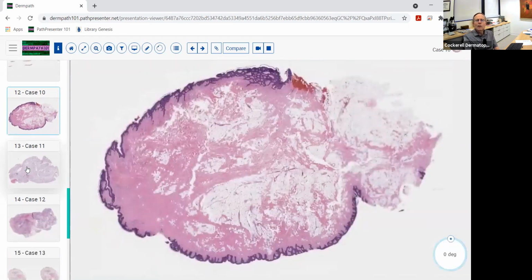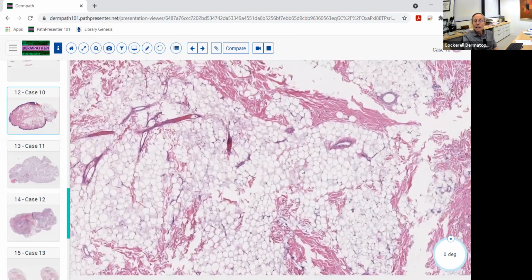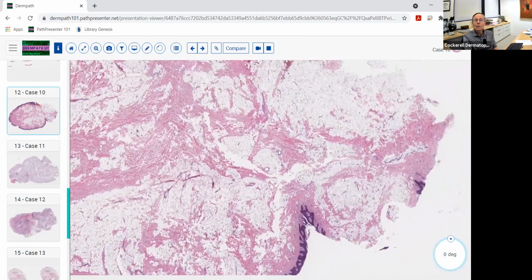And there are several other variants of subcutaneous neoplasms. There's a fibrolipoma. Again, we talked about spindle cell lipoma. We really didn't show that today, but just realize that that can look a lot like a myxoid lipoma. Now this, if you look at low magnification, looks like a skin tag. And if you looked at it in the clinic, in a patient, it might look like a giant skin tag also. But the thing that's different here is that you've got a ton of fat in this lesion, and notice that the fat is present prominently near the base of the specimen.